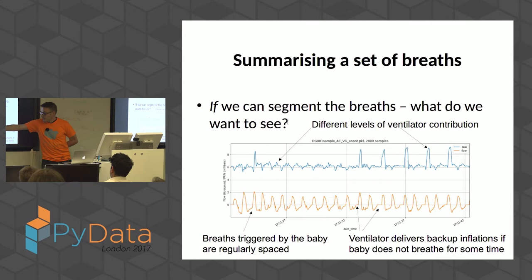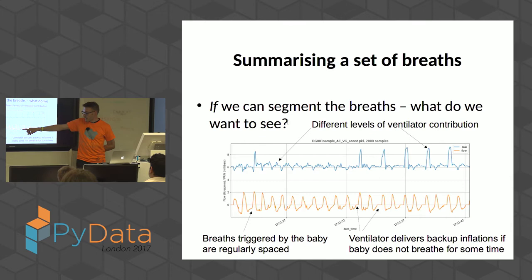So we can see babies breathing regularly. So we get these nice sinusoidal-like waves. And then we get periods where there's a long gap. And when this long gap occurs, either the baby isn't breathing or it's having trouble breathing. And the ventilator's waiting, and it's waiting, and it's waiting, and it goes, oh my God! And then it starts pushing air into the baby. So the baby gets a full breath of air. So we can see these long gaps.